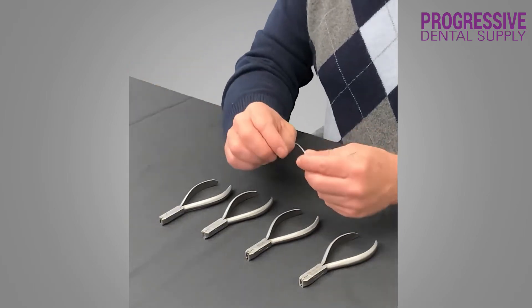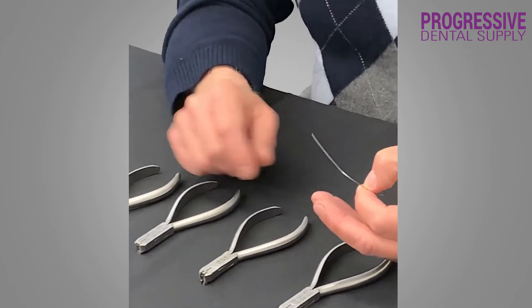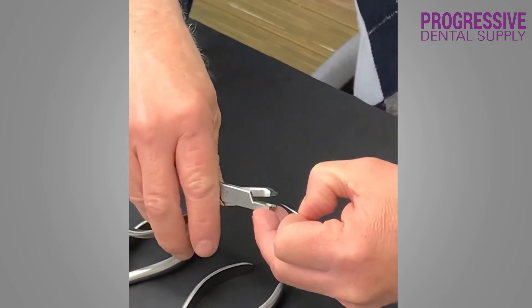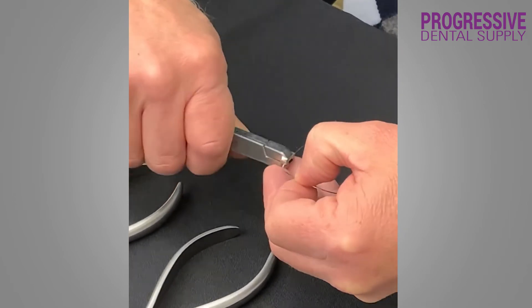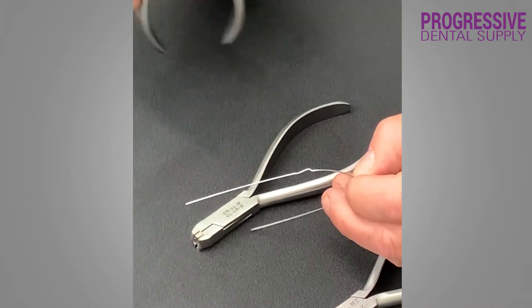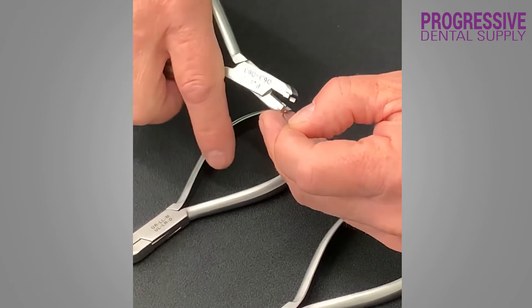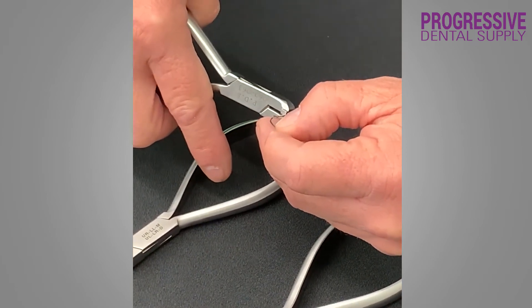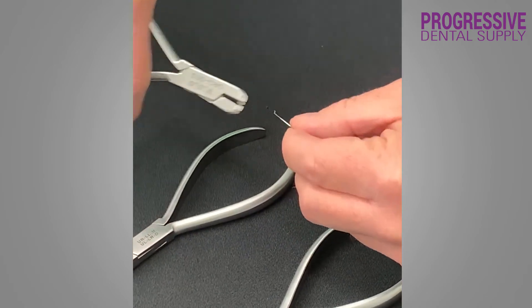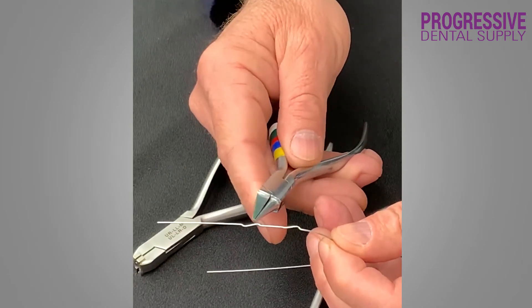I made sure that these pliers could be used to bend any of these wires. Here I have a piece of 18x25 heat-activated arch wire, and on this wire I can make any bend I want. This plier I'm going to show you right now is what we call the Z-bend plier, where both marginal ridges move. I just place the arch wire and give the plier a full squeeze, and here you have that Z-bend.